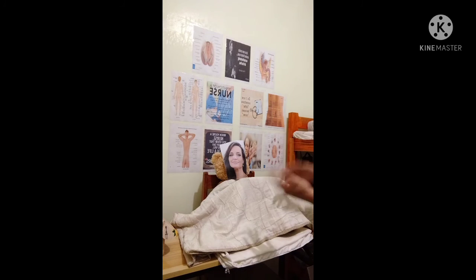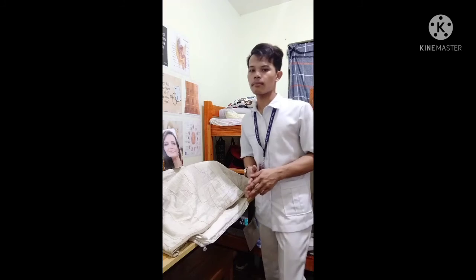So after draping back our patient, of course we need to perform hand hygiene. Then after hand hygiene or hand washing, we need to record the time of the procedure done, the amount, and the color of the initial output. This is actually to prevent contamination, for proper documentation, and to enhance proper handover and endorsement.